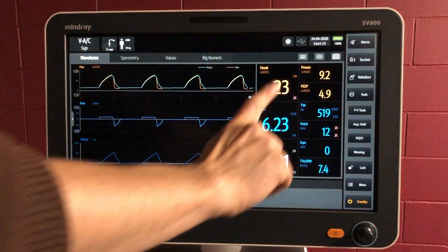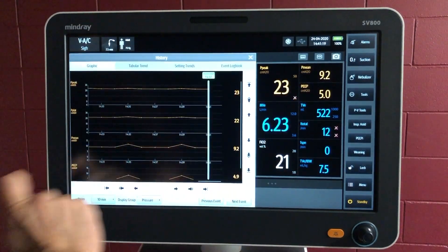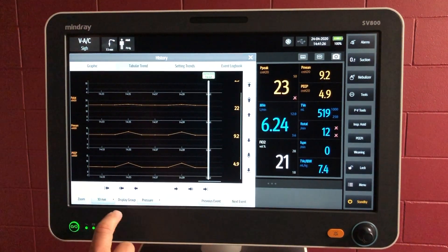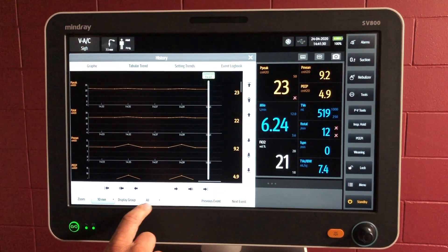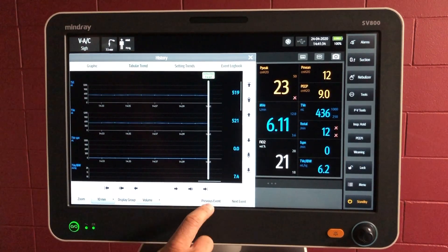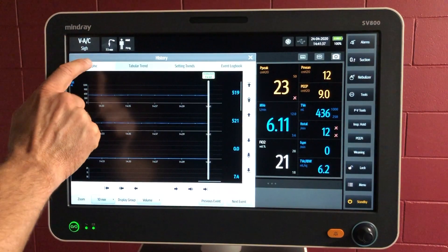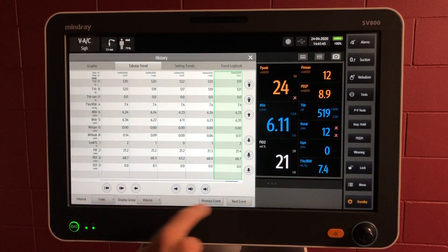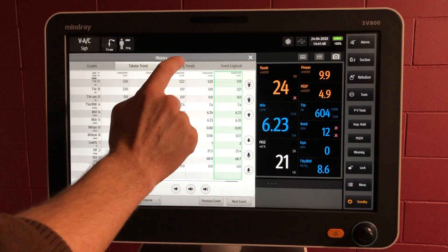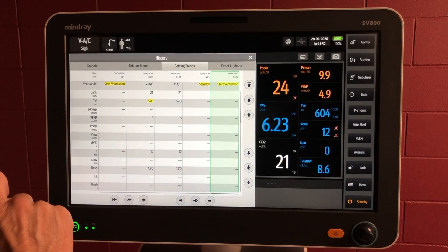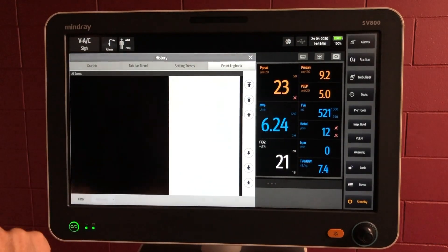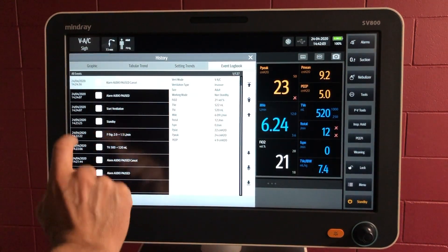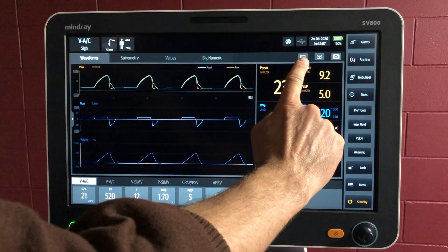Let's have a look at some of the buttons in the top right-hand corner. The first one is the history. This shows you graphical trends — you can navigate with those arrows on the side, zoom in, and choose display areas like all of the parameters or just the volume waves. You can toggle between events. The tabular trend shows you a tabular form of the data with similar navigational features. Setting trends shows you what's been changed with the settings — the history of changes. The event logbook contains all the different alarms, messages, and changes. So that was the history button.